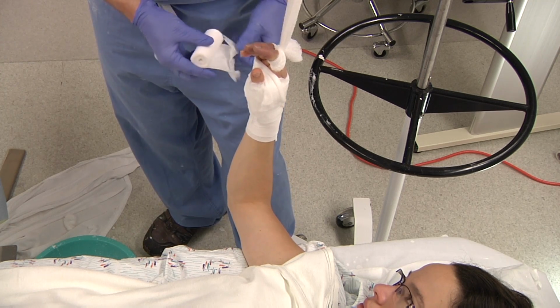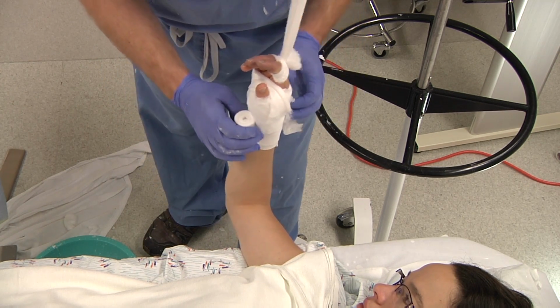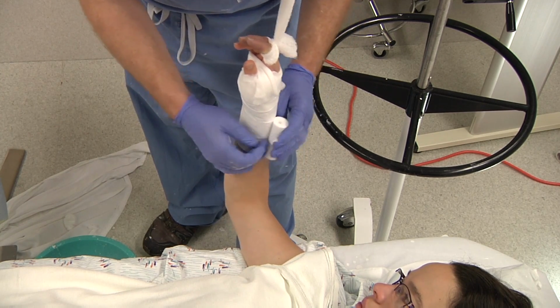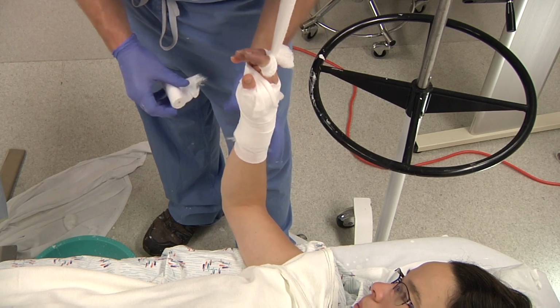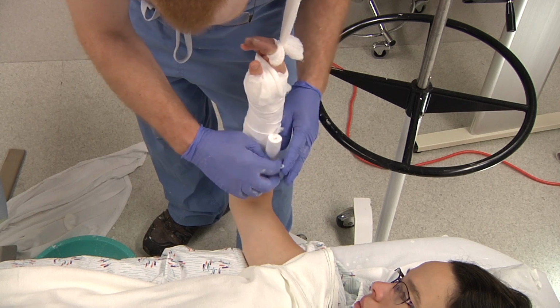From there, continue down the arm. Try to avoid excessive wrinkles. It's very simple to tear those out.